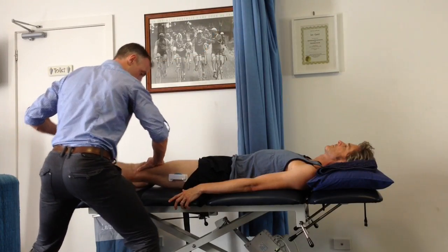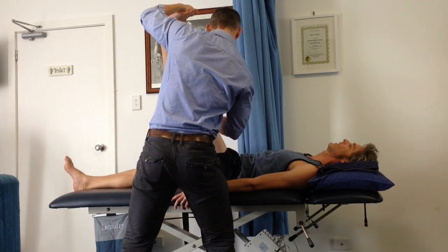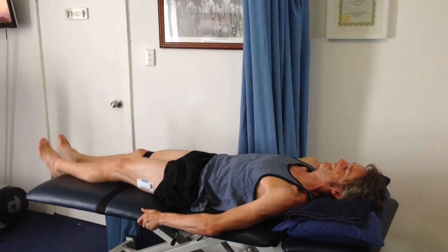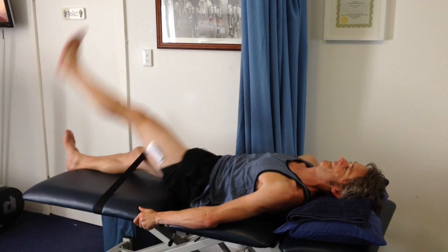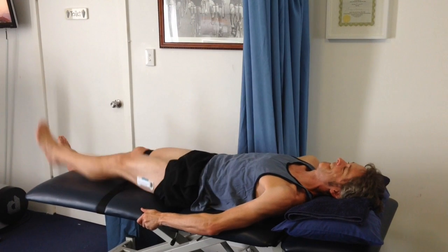The straight leg raise is first performed passively with the therapist assisting. Once this has been done we then perform an active straight leg raise, here first shown at full speed and then we will slow that down so you can see the activity of the leg through range.